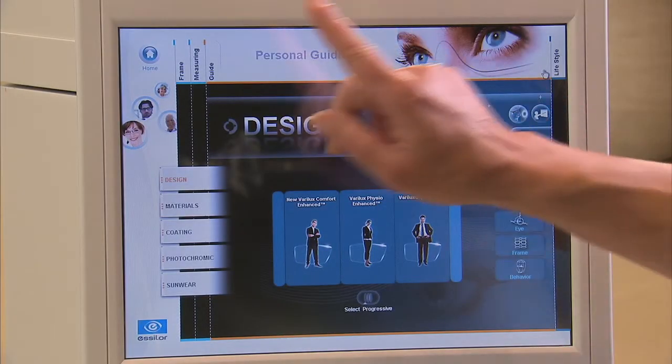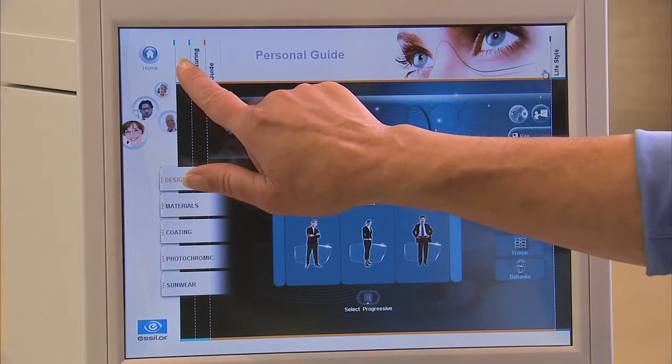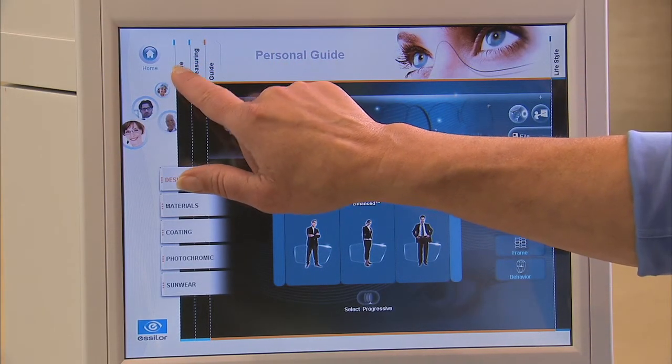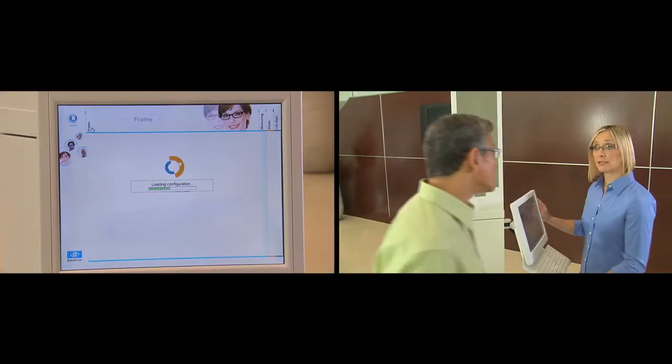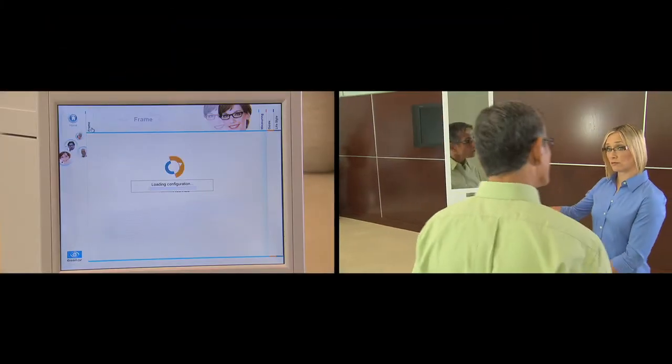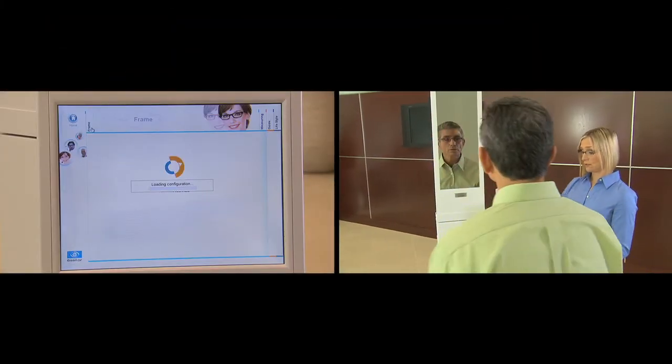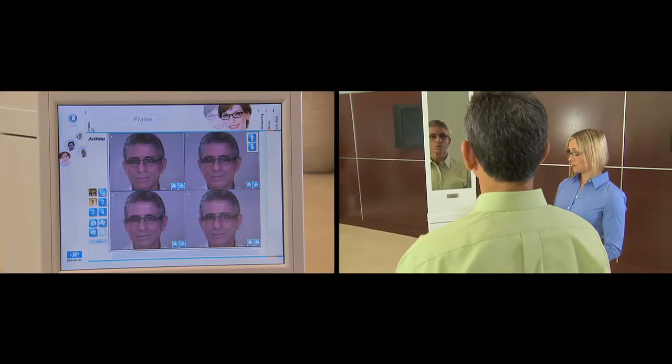Click on the frame tab at the top of the screen. Have the patient stand in front of the mirror with his or her chosen frames.